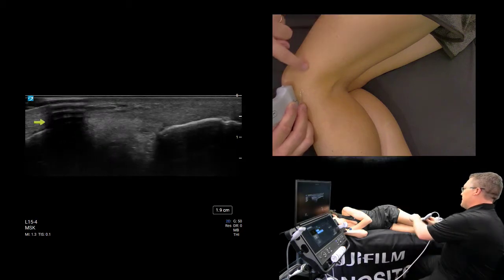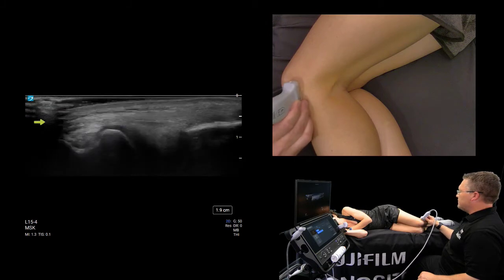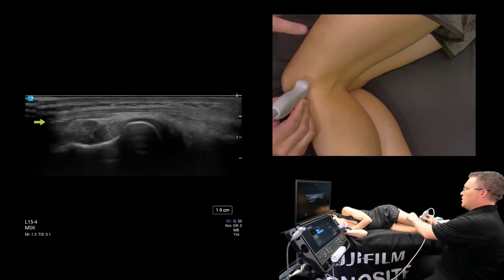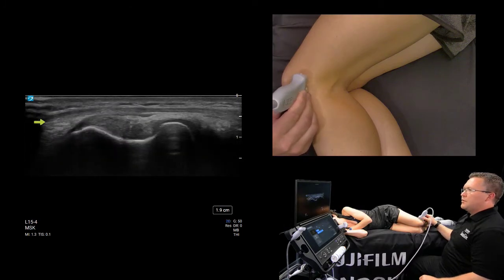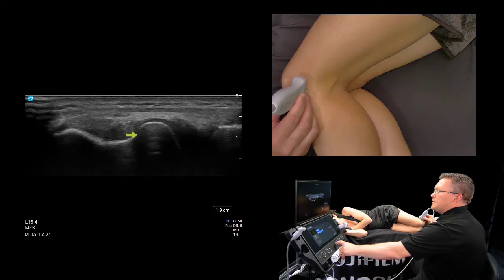And I know the IT band is coming from the lateral thigh. So it originates out on the lateral ilium. And I know I need to point my probe that way to get it in its long axis, okay? So here we can see the IT band jumping over the popliteus groove, lateral epicondyle of the femur, and we'll get to that on our LCL.